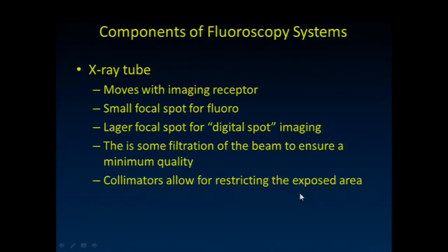Well, let's talk a little bit about fluoroscopy. So, and you guys know this, there are a lot of different fluoro systems, whether you're in the IR room or you've got the GI fluoro unit or you've just simply got a C-arm unit. The point is they've got a receptor and they've got an X-ray tube that kind of move in concert with each other.